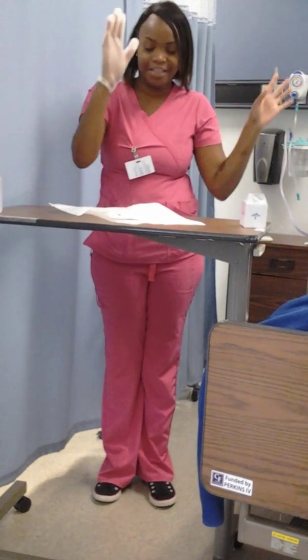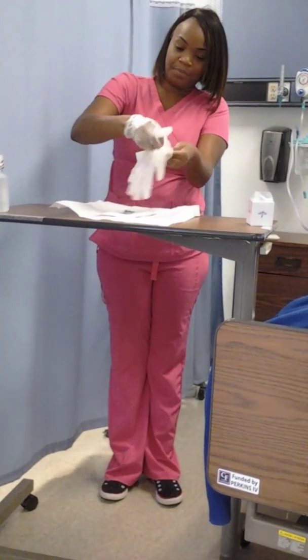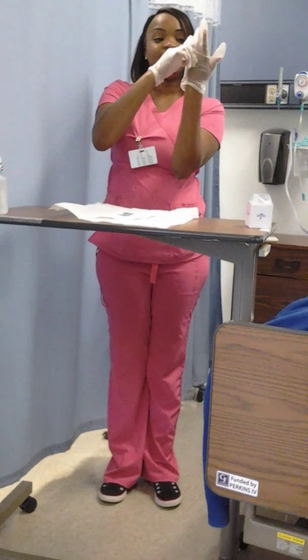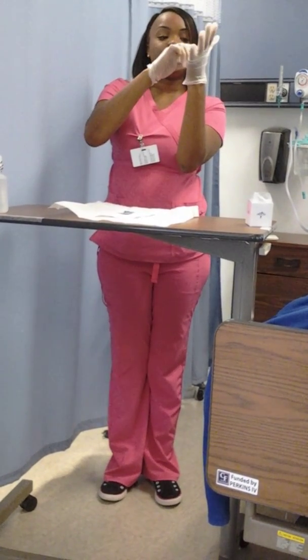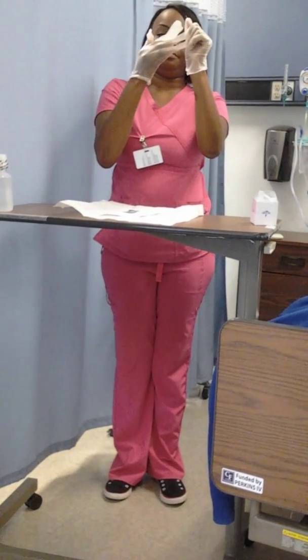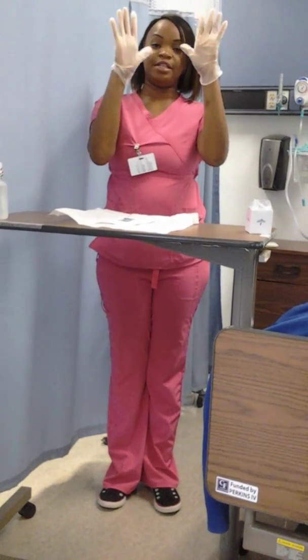I got an extra set. Thank God I do. I'll go ahead and attempt to put this one on. I'm going to check my thumbs. I didn't contaminate it. So now since this one's on, sterile can touch sterile, I can use this hand to fix this one. I am still sterile. Did not break sterile technique, and both of my gloves are on.